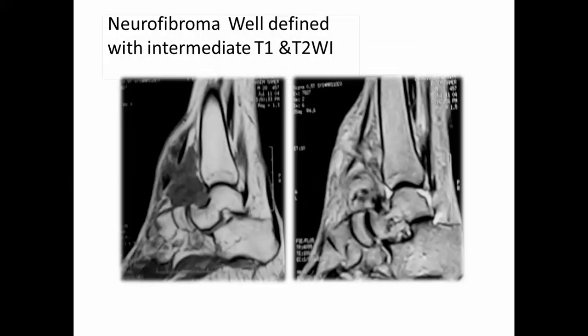Neurofibroma is a well-defined tumor, usually multiple, and it will show intermediate T1 and T2 weighted intensities.